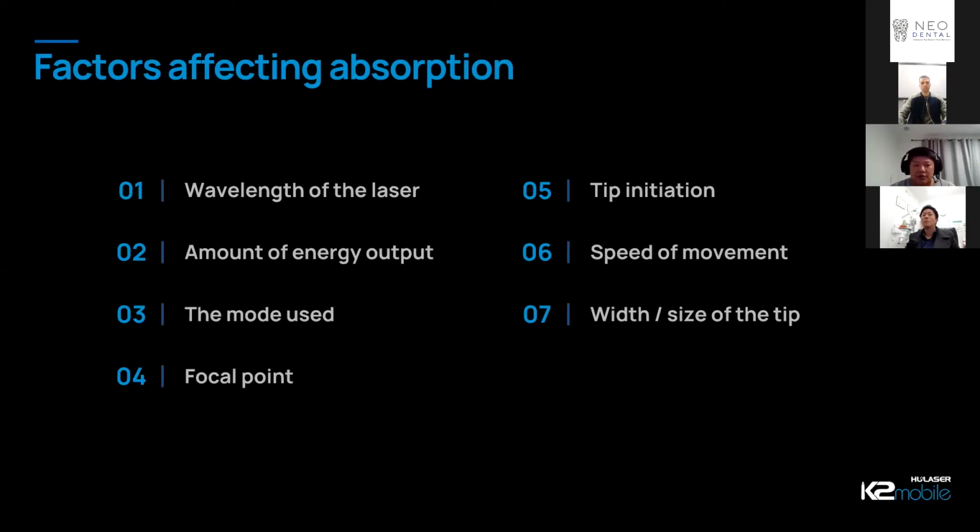So I'll show you the laser that I used to use in the past, and that's around 800 nanometers, and this K2 laser's 980. And look, I find that it's clinically probably not so relevant. I'm happy to be proven wrong, and I may be using it incorrectly, but that's anecdotally what I found. They're both just as effective, but there are a lot of advantages about the K2, which I'll talk to you about in a second. Obviously, the amount of energy output, pretty self-explanatory, I hope. So the more energy, obviously, the more effect.